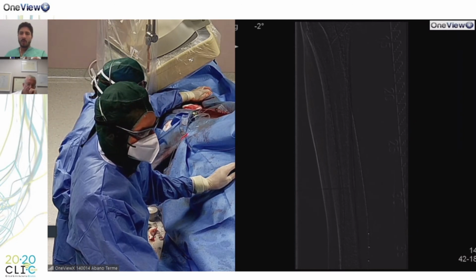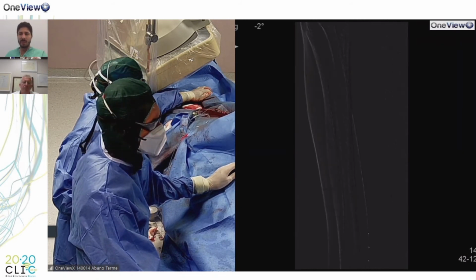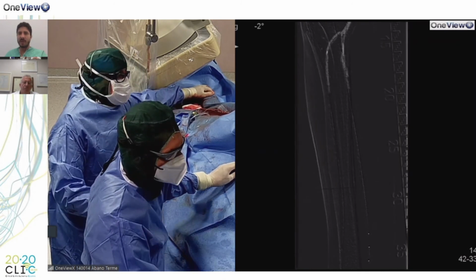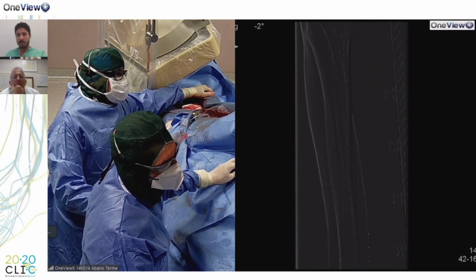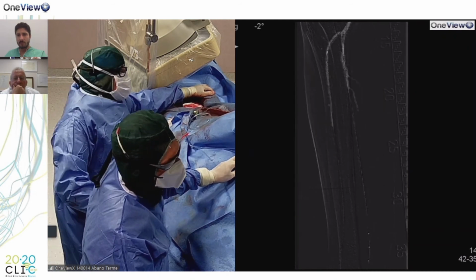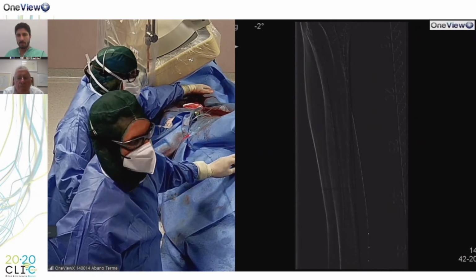However, we were able to see the gas passing till the ankle. There is some noise related to the movement, and I believe you still have the guide wire in, but for sure now the vessel has flow. We dilated at 3.5 in the top. And then I arrived with the wire in the ankle in the posterior tibial.